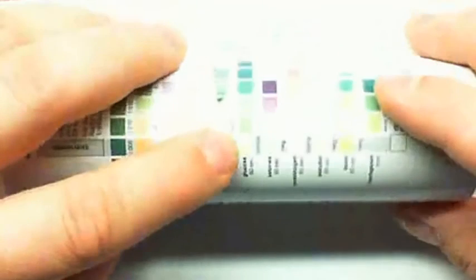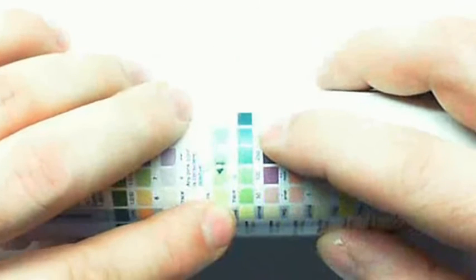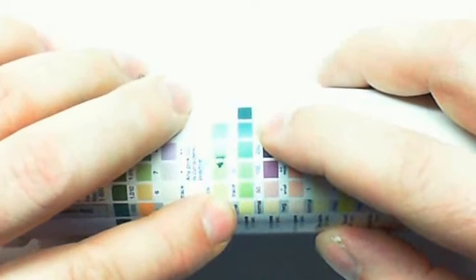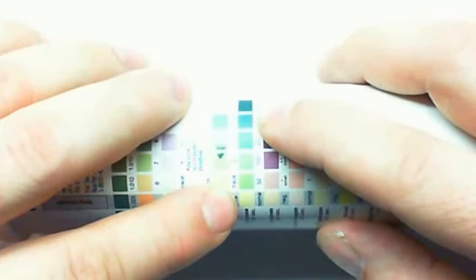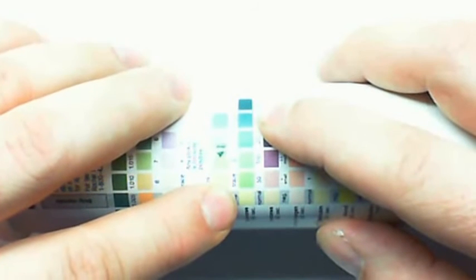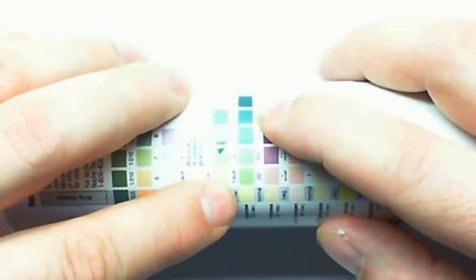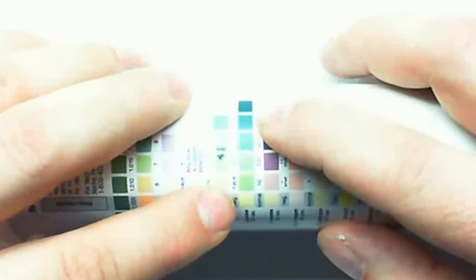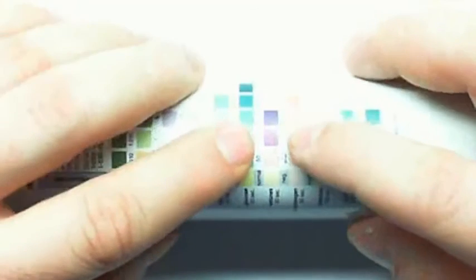Moving down to glucose, if the urine stick shows bright green, that's the presence of glucose in the urine. Now normally glucose actually passes through the filtration membrane, but the body doesn't want to lose that glucose, so it takes almost all of it back up, really all of it, in the proximal convoluted tubule. Glycosuria is when there is glucose in the urine, and that's usually a sign of diabetes mellitus. It could be anything else that causes breakdowns in glucose metabolism too, things like liver disease and pancreatic disease. Usually high glucose is going to be accompanied by ketones too.